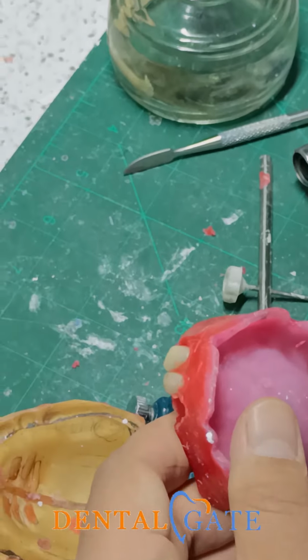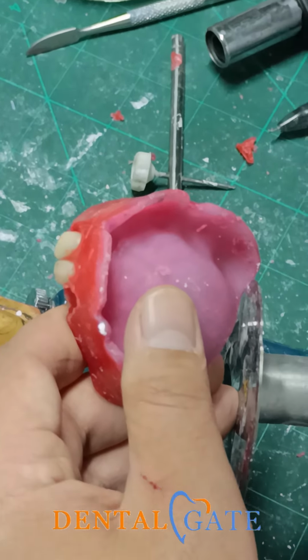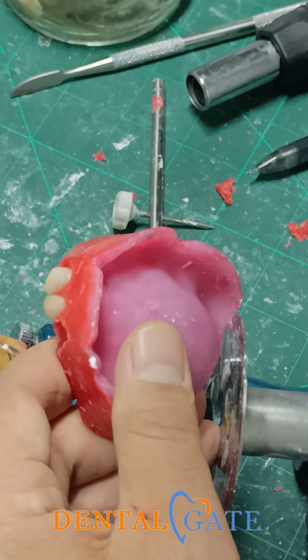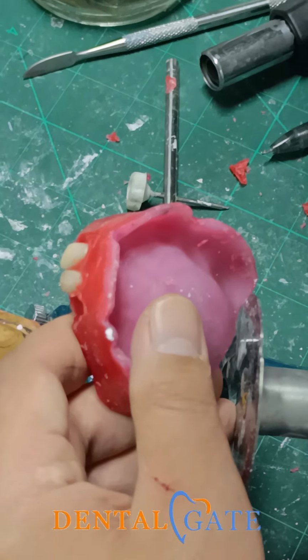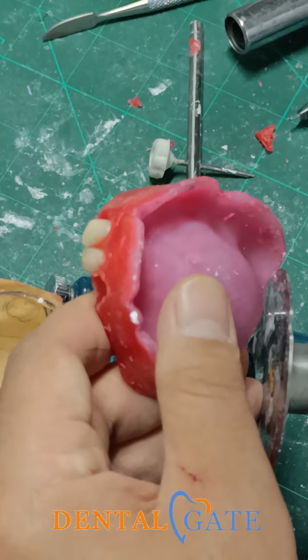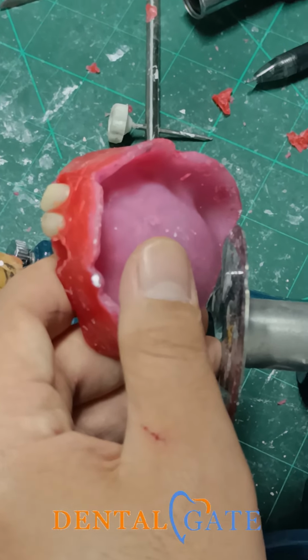So the incisive papilla gives two main criteria. One is the midline, if you don't have a reference in the patient's mouth, and the second one is the position of the central. So this is the start segment for the anterior teeth.